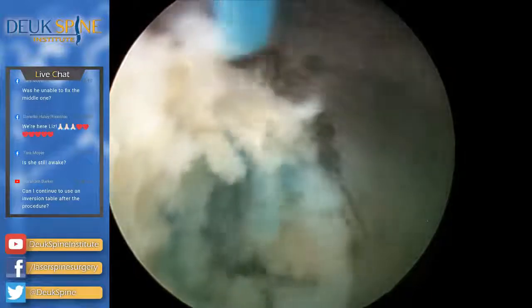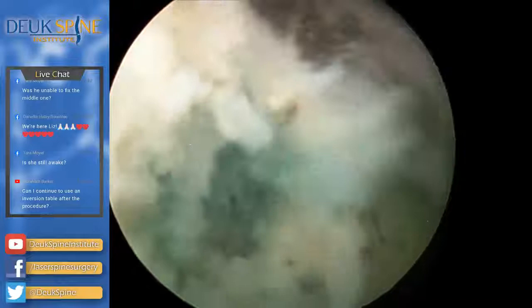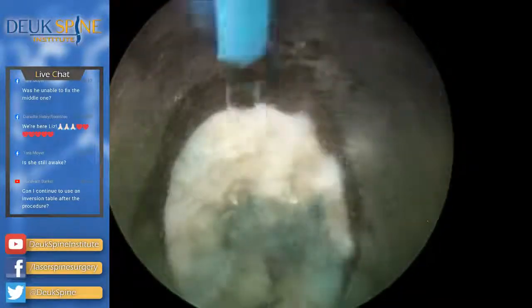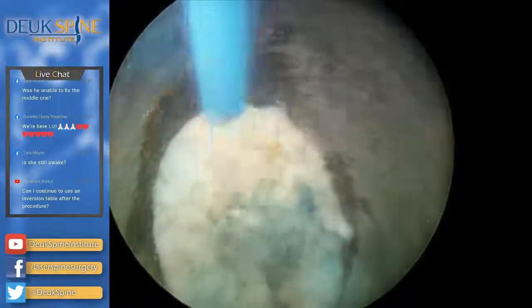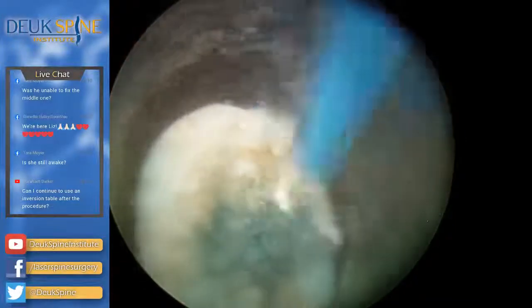I tried side firing lasers years ago. Five minutes, and I just hated it. Not being able to see what I was zapping, and also the power gets diminished with a side firing laser, so you need to crank the power up even higher to get an effect.